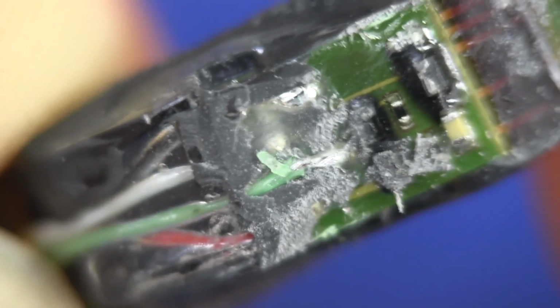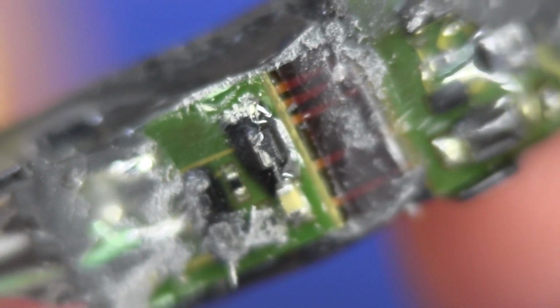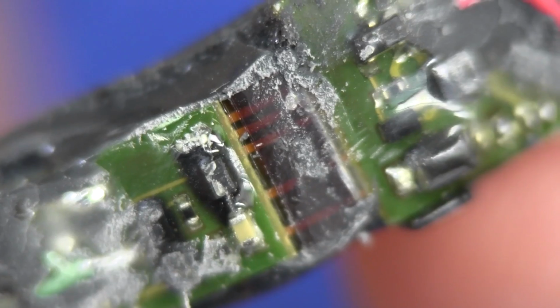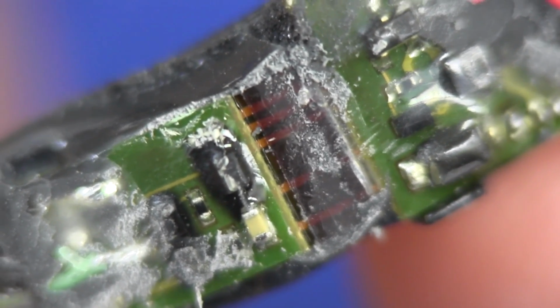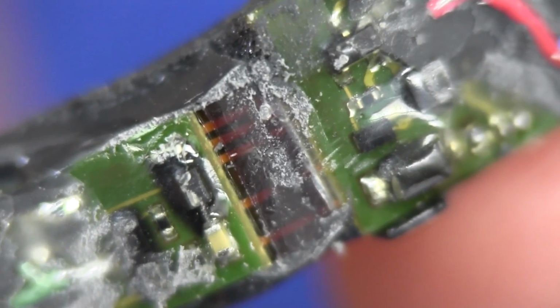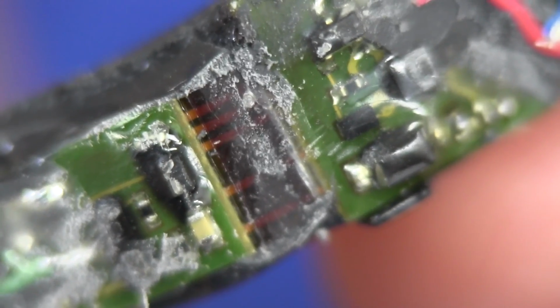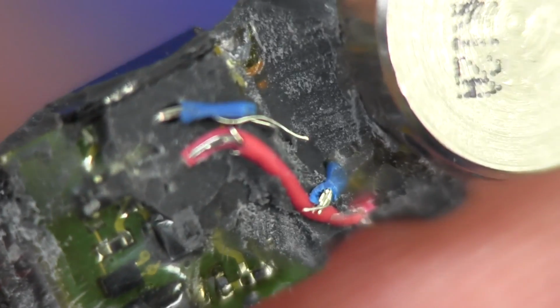And here's the other board where the wires come in from the TRS jack, and there we go, there's a good example of the flex membrane, which is sandwiched between the board I was telling you about. There you can see this separation in the two boards like that, with the flex material in the middle. So maybe I'll try and actually extract these boards, and then you'll get a better idea about that. But then look, there's a little SOT23 package, and that's all around the accelerometer there.